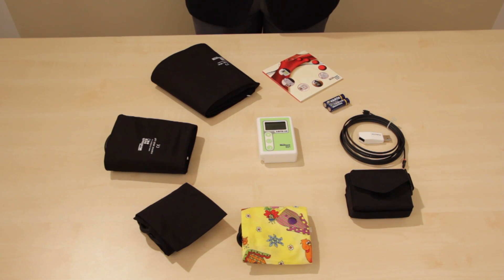Congratulations on your choice of Meditech ABPM05, a compact, silent, lightweight ambulatory blood pressure monitoring device, which with all its accessories has been presented here for you.